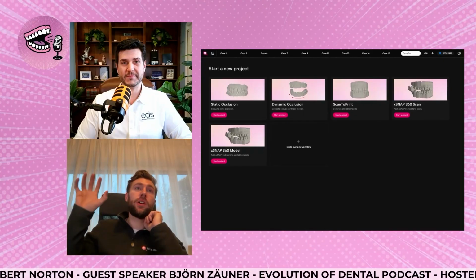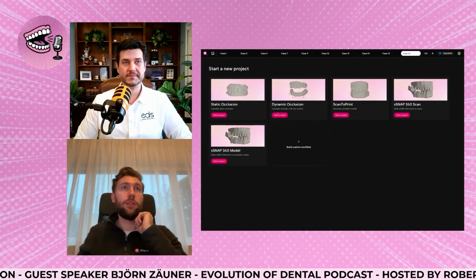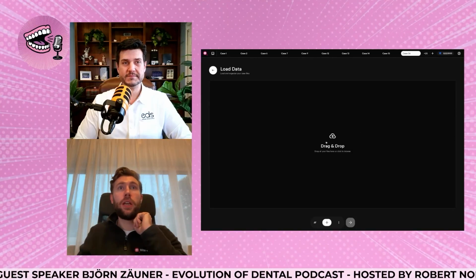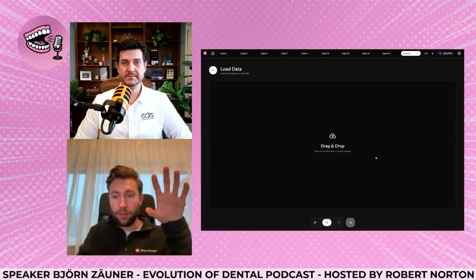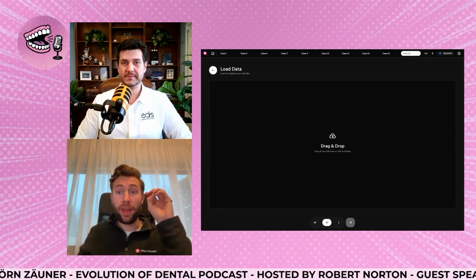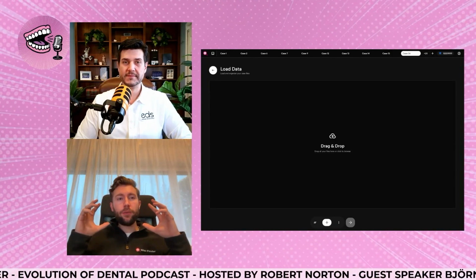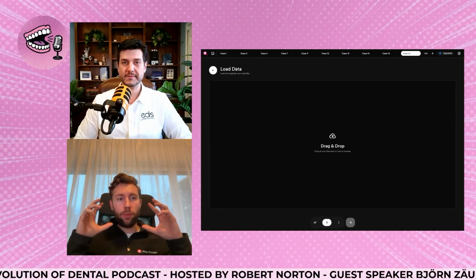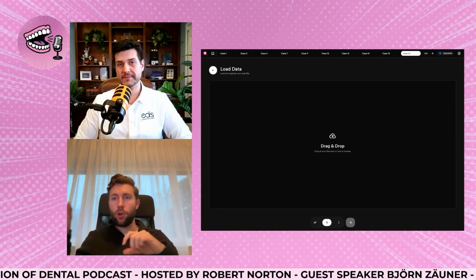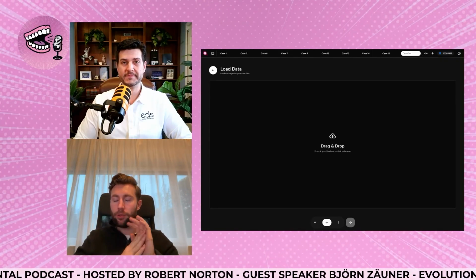Essentially, now you start with this screen, you choose what you want to do, and then, let's say dynamic occlusion, you just put in all the files you need. That's the next big thing we changed. We started with the basics, upper and lower jaw, but people asked, can I also do more complex cases, and what about margin lines? It got a bit crazy.